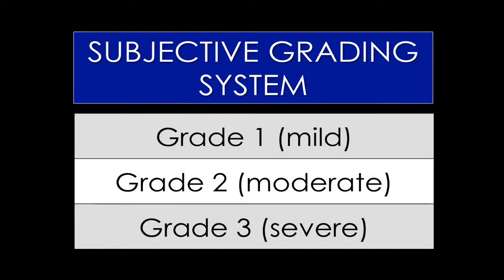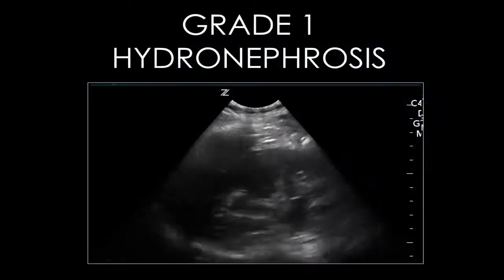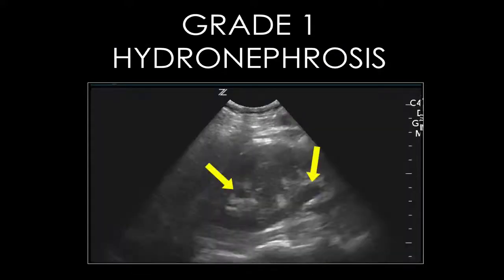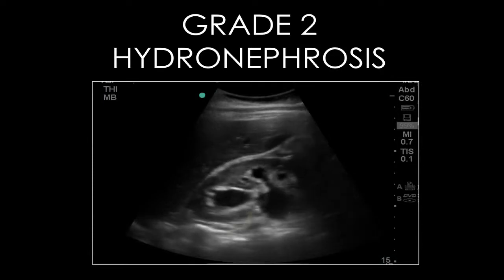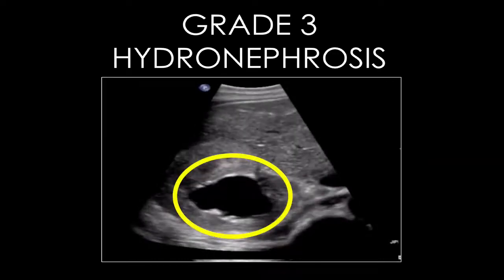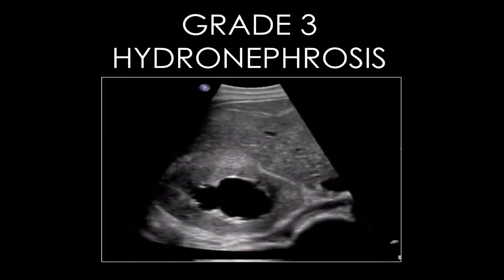A subjective grading system is sometimes used to describe the extent of the hydronephrosis, with grade 1 being mild and grade 3 being severe. This video demonstrates grade 1 hydronephrosis, where there are collections of urine separated by renal tissue. With grade 2 hydronephrosis, the renal pelvis and major calyces are confluent. Grade 3 hydronephrosis demonstrates extensive compression of renal tissue due to prolonged high pressure in the renal collecting system.